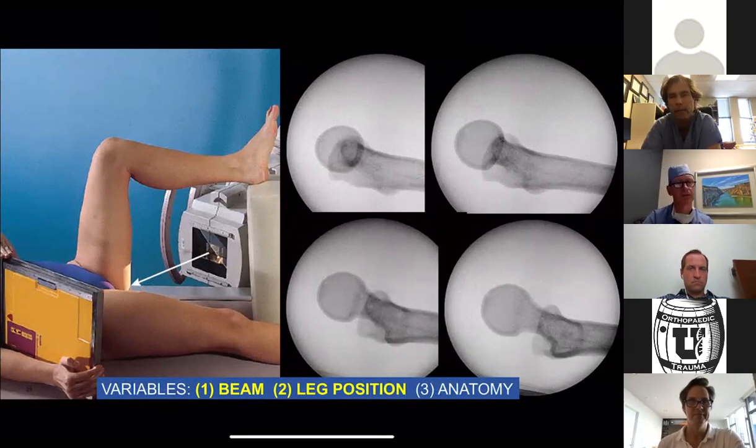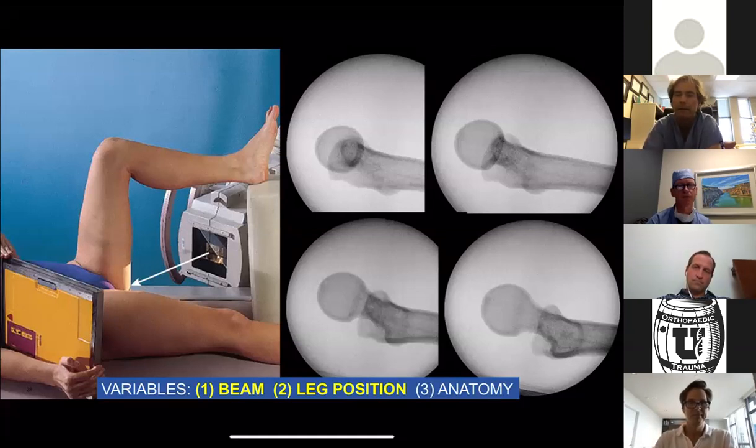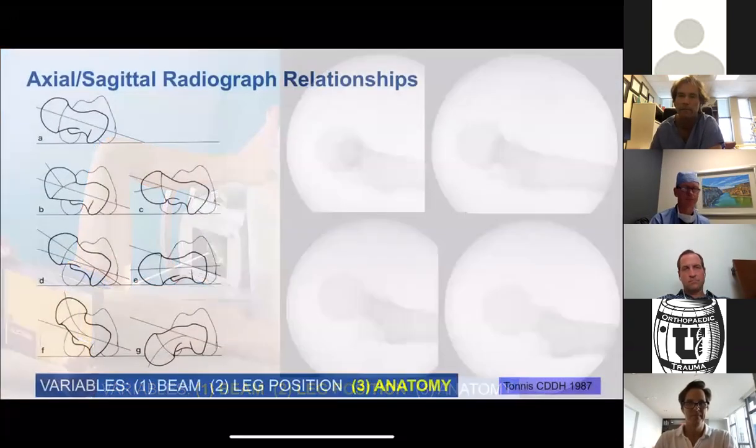And this is actually possible now, with the guides that we have available now for insertion, oftentimes they will not be in the way when you try to create more obliquity like this. It allows you to see things a little bit better. And so recognize that in the same rotation, you can uncover more of the neck by changing the obliquity of the C-arm to the limb. This is very helpful when you're dealing with proximal fractures.